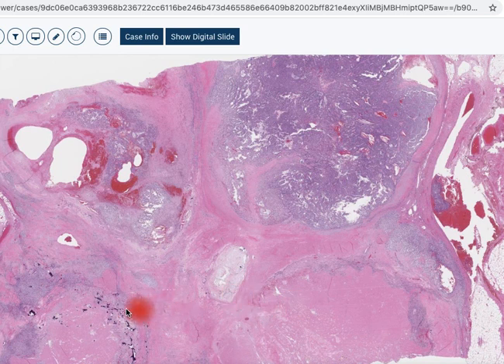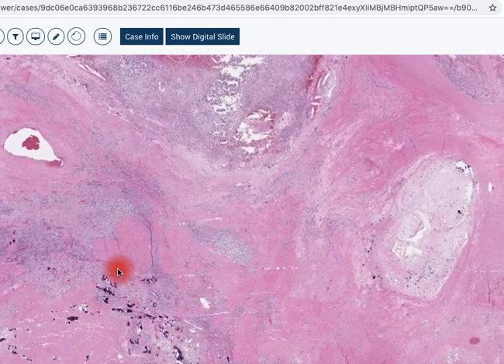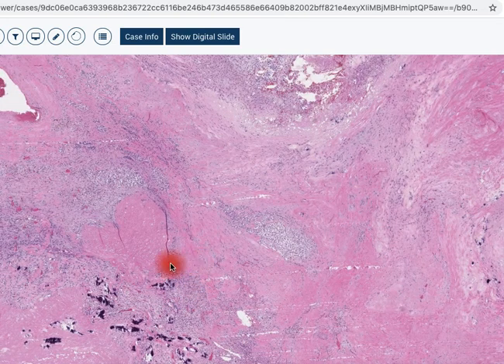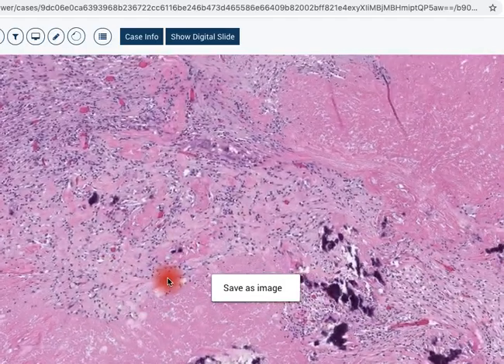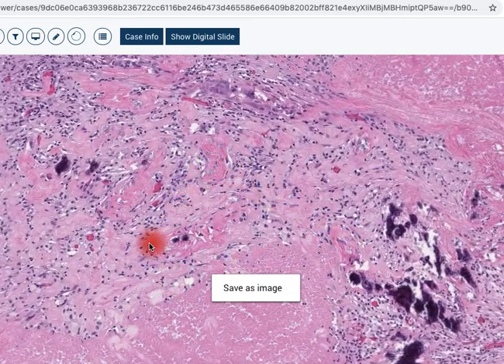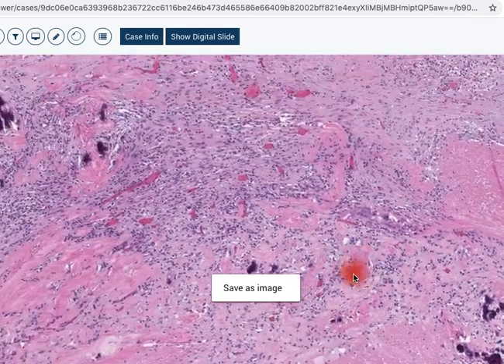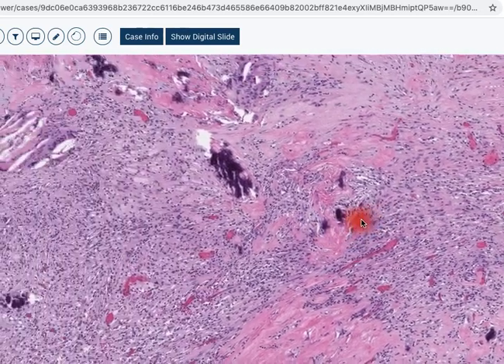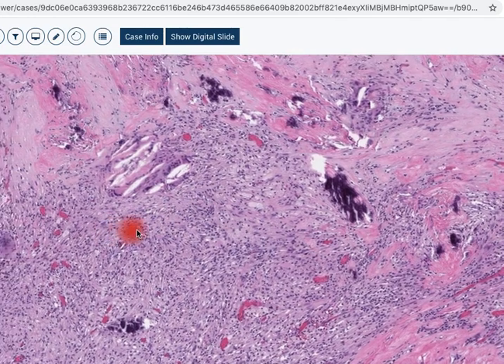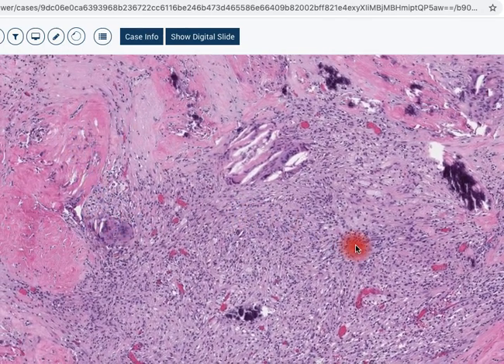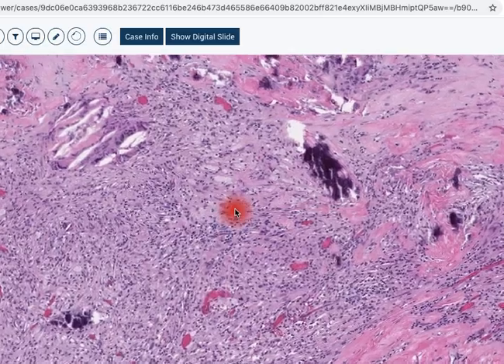Let's start and look at, first of all, what this necrosis looks like over here. Here we see there's some calcification, a little bit of reparative changes, and then maybe a little bit of a sort of tumor cell over here. We see some cholesterol clefts and multinucleate giant cells, more giant cells here, and scarring. So this doesn't look like it's really a tumor per se, but it looks like it's some sort of repair or reaction to something that's been here before.